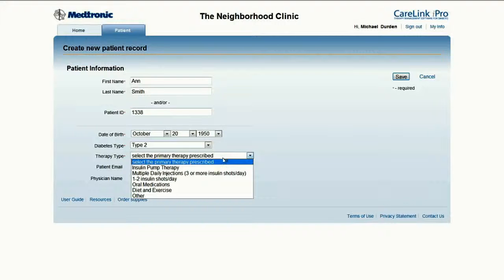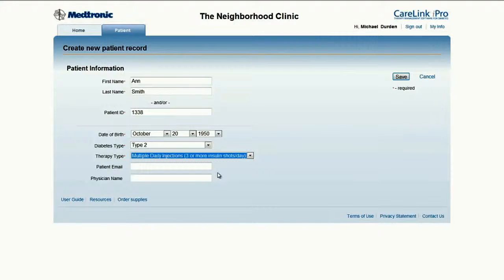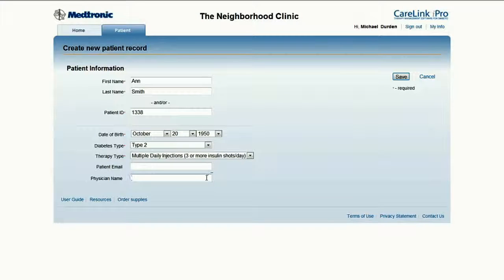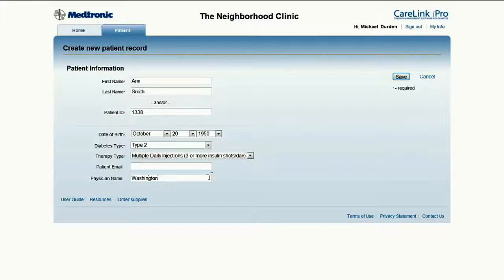Ann is on multiple daily injections. The last two fields are optional. However, if there are multiple physicians in an office, it may be helpful to enter the name of the physician. In this case, Ann goes to a large practice and sees Dr. Washington. Click Save in the top right corner to complete the process.